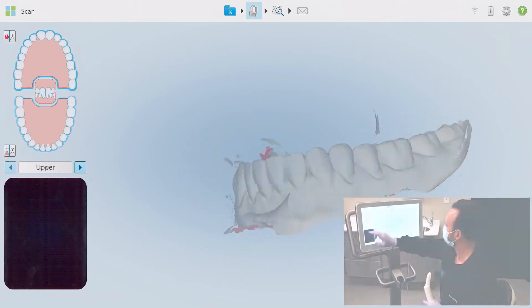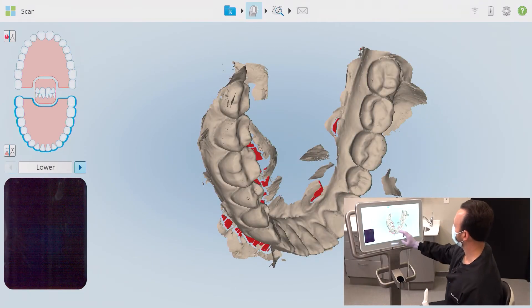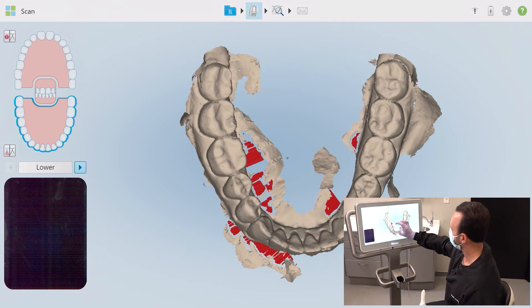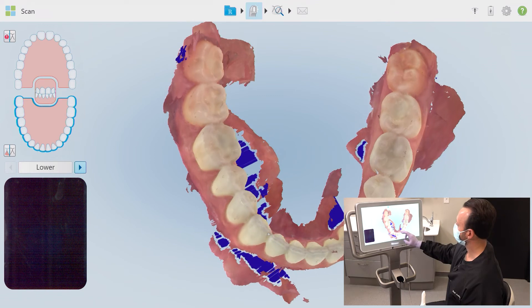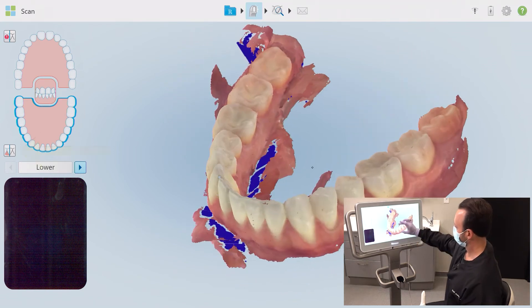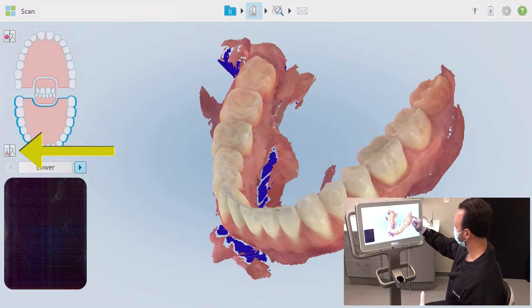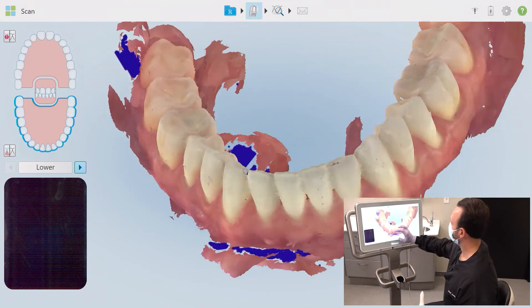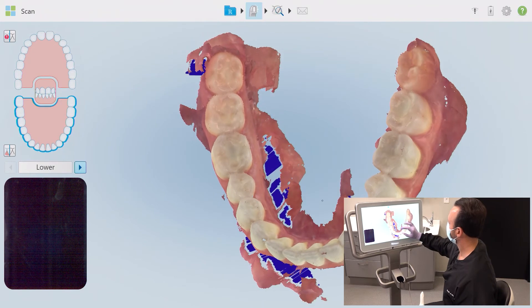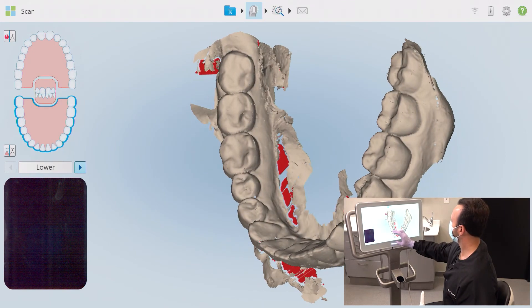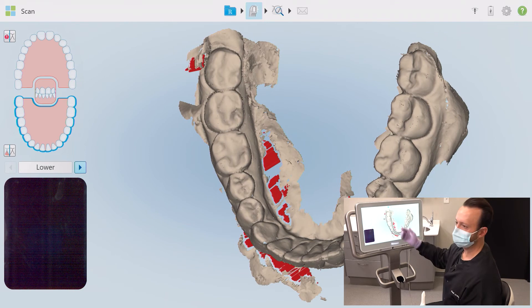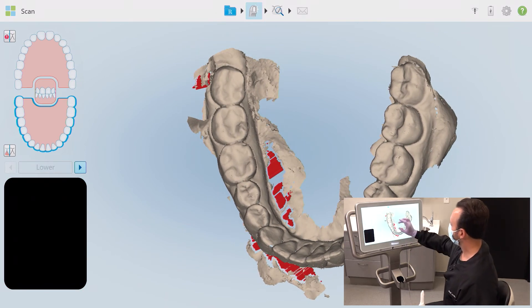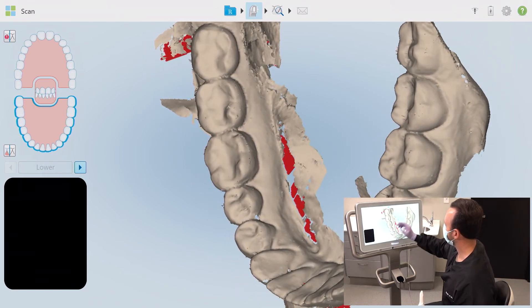While reviewing the final scan, here's an option that I like to take advantage of. Since I've been looking at the same grayscale image for so long, it helps to give my eyes some relief and change the image appearance to the high definition view. I do this by clicking on the view button located just to the lower left of the tooth chart. Now we have more of a gingival color contrasted against a natural tooth color. I prefer to scan in the grayscale mode, but it really is up to you whether you choose one or the other. Remember, when it comes to performing scans properly, your comfort level directly translates to the best possible outcome.